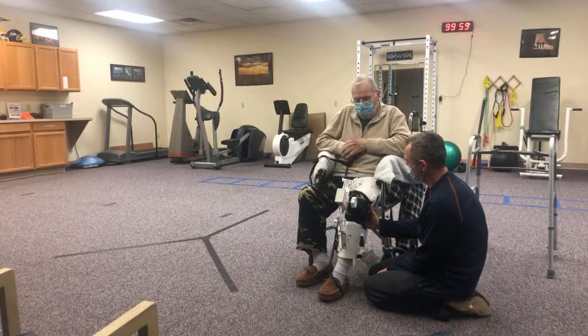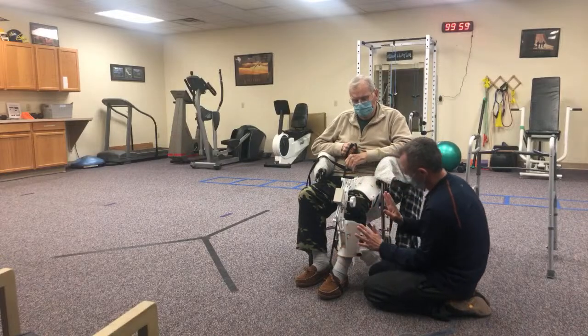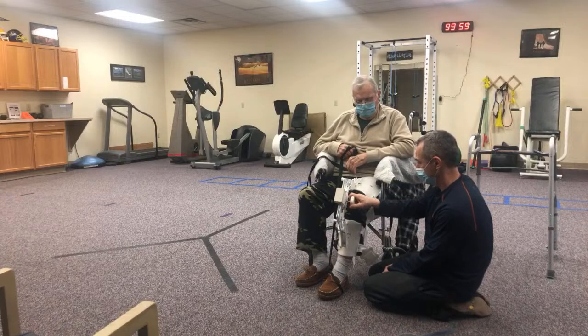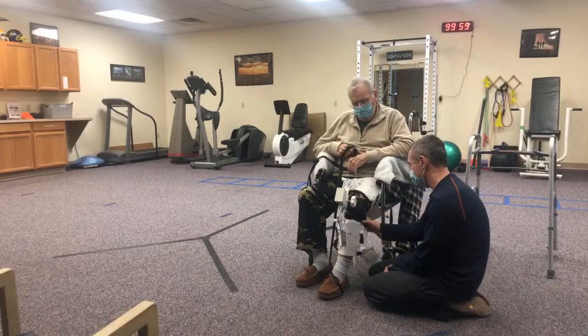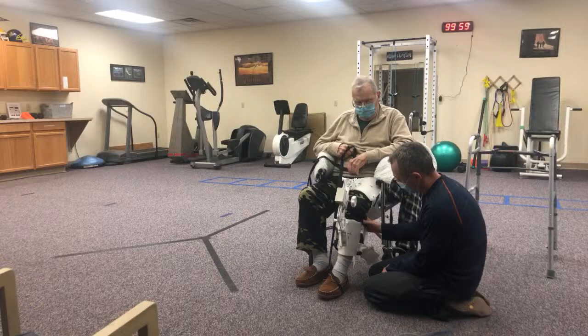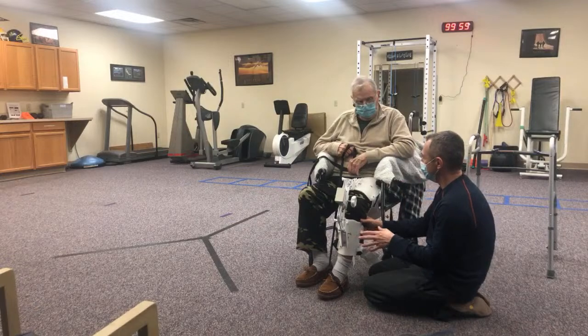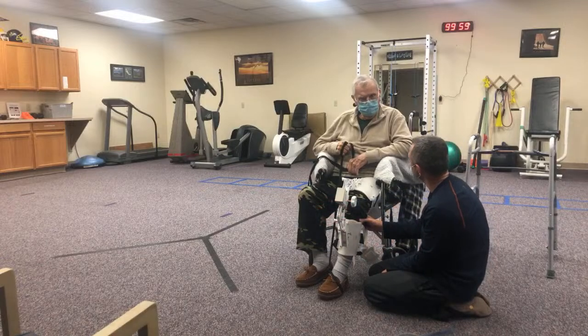Let's give it another little pull. The best range of motion you had when your therapist at home was pushing was 83. Do you remember how close to zero you got when it was going straight? No, okay - you might not remember that, or he might not have made an issue out of it.